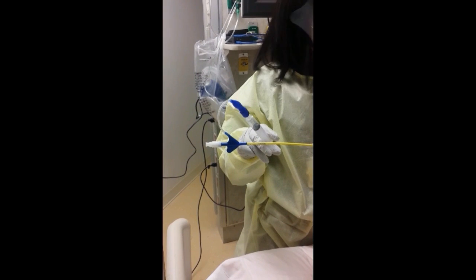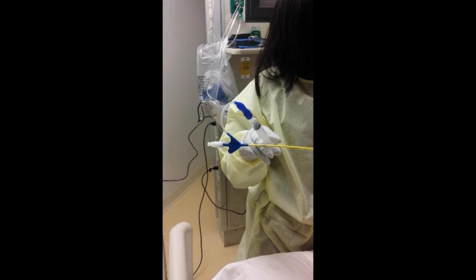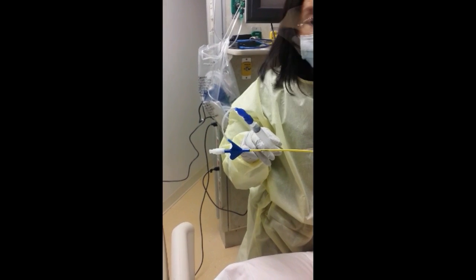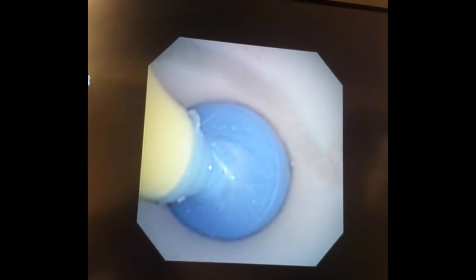Using the aspiration port with the syringe attached, insufflate the balloon until the desired airway is occluded.